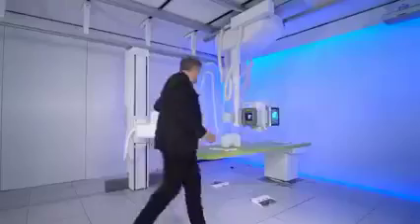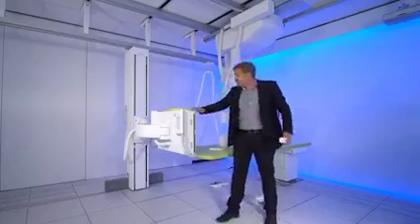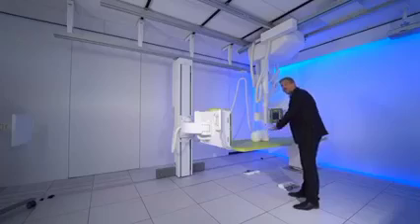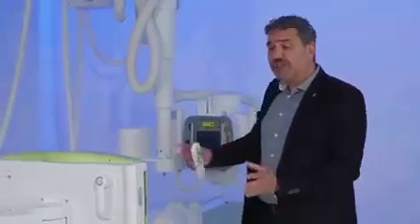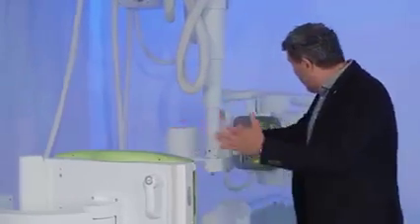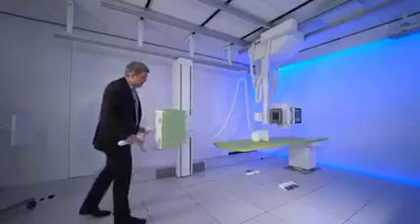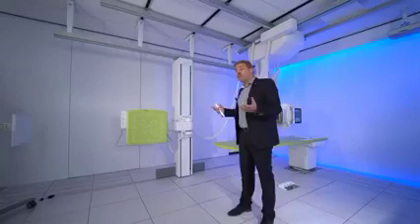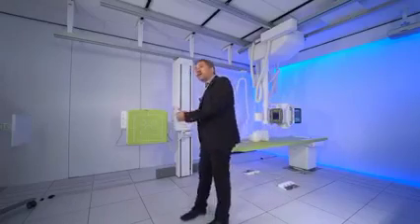So a lot of advantages, the flex room, but also this VM wall stand, the mover wall stand, will bring to you. What you have seen now is that you can do all examinations in horizontal way. Special projections you can achieve because of this unique vertical movable wall stand. But they were still all in this direction. The thing is that with one simple handling, I can now change the position of this wall stand towards the table, but also towards your own room layout.